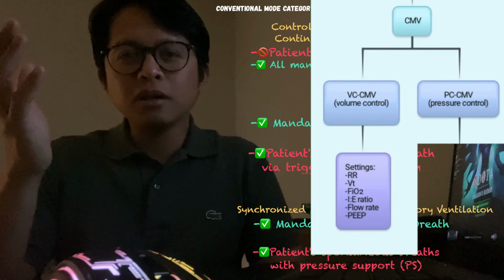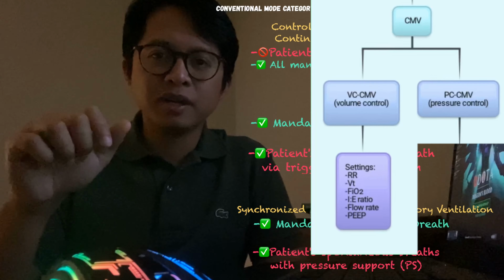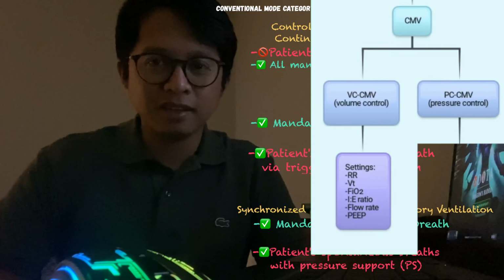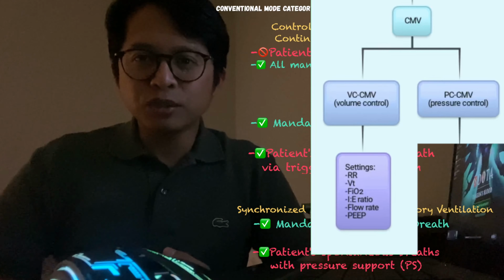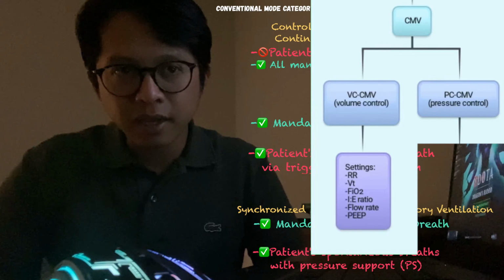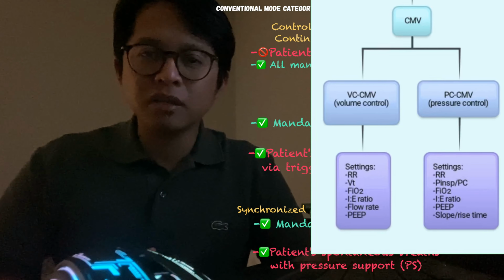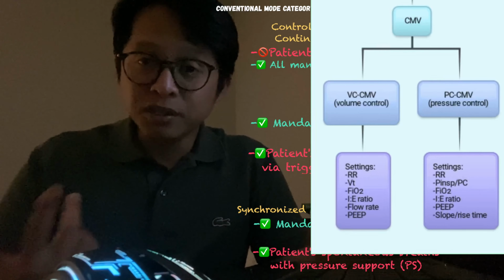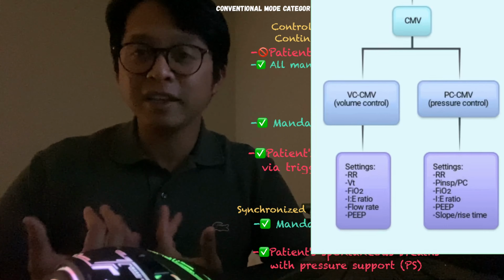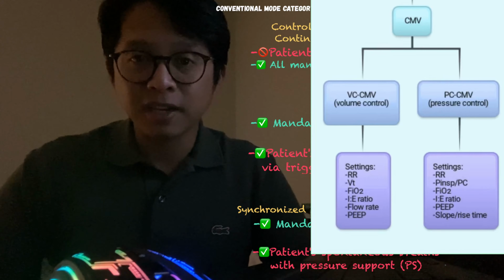How about PC-CMV? During pressure-controlled ventilation, you have a set pressure and set inspiratory time, and the patient can't do anything in between. During pressure-controlled ventilation, two pressure levels are kept constant, the PEEP and the inspiratory pressure. The possible settings in this mode are FiO2, inspiratory pressure, often called PC or pressure control, I time or the inspiratory time, RR, PEEP, and slope or rise time.